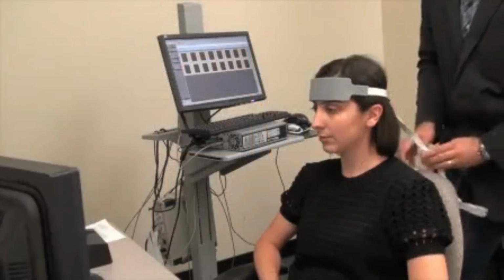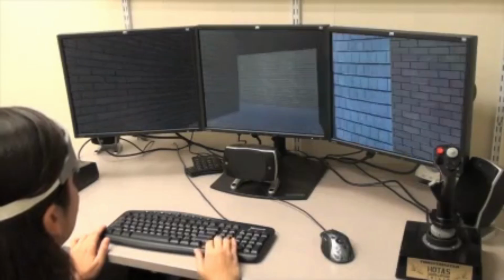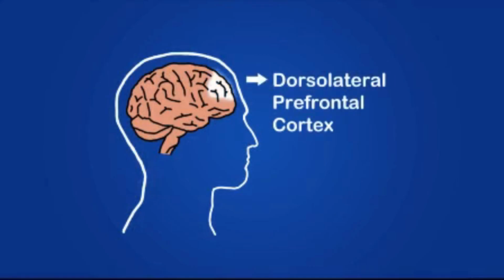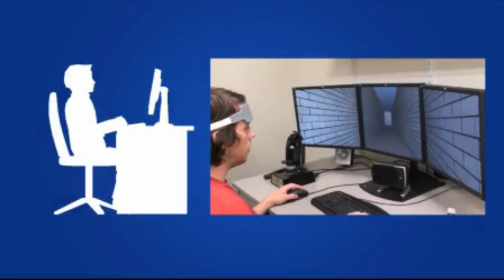To demonstrate these, a subsample from a study is reported to show how to use both MazeSuite and fNIR in a single experiment. The study involves the assessment of cognitive activity of the dorsolateral prefrontal cortex during the acquisition and learning of computer maze tasks for blocked and random practice orders.